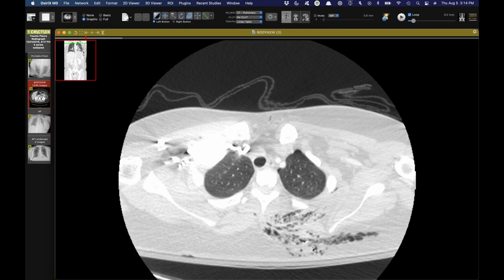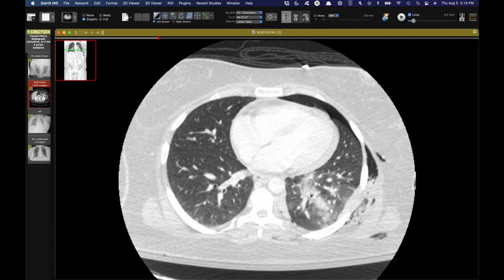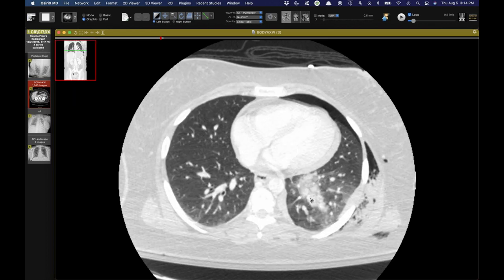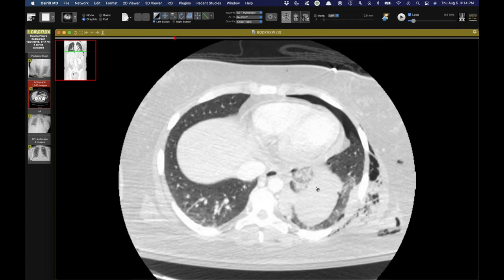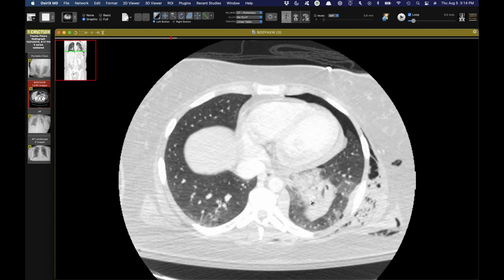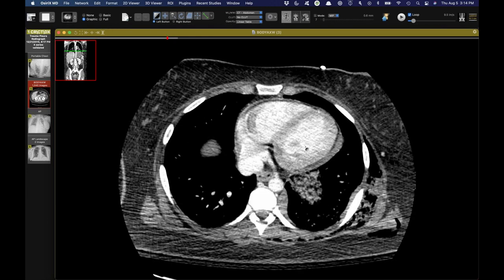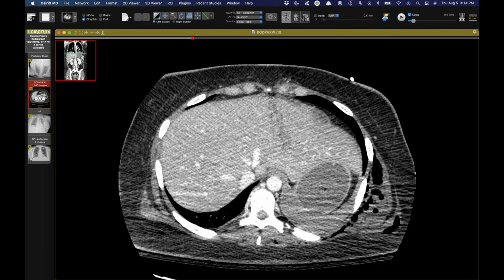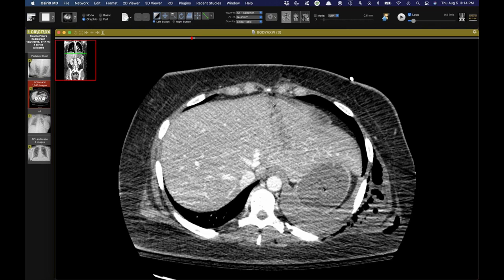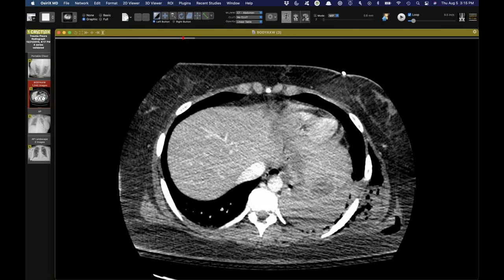There's really not much pneumothorax, but I think the lower injury is more interesting because you see in the left lower lobe that there's an area of contusion and what turned out actually to be a laceration as well. I'm not sure how much of this is laceration, but there's certainly some, and a lot of blood from contusion. It's interesting to figure out how the bullet actually got there, because there's nothing through the heart. It's only when you look inferiorly that you see there was an entry wound here by the costal cartilage, a laceration of the liver, and that this went right under the heart.